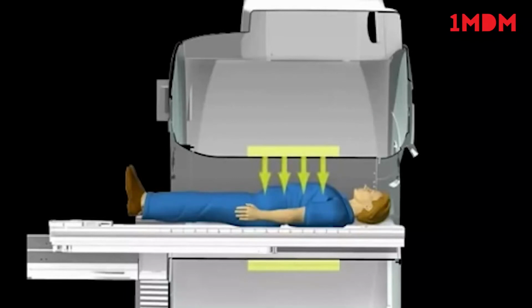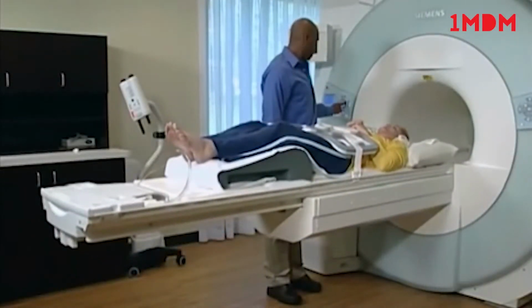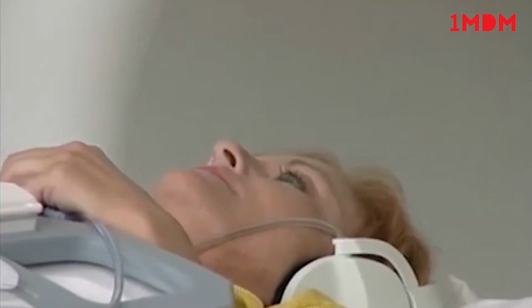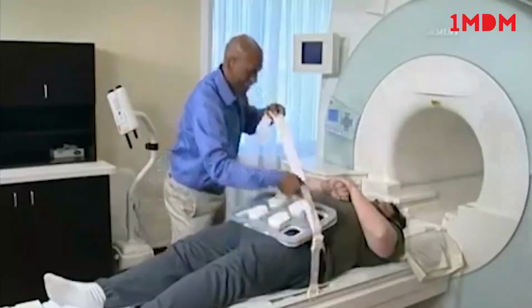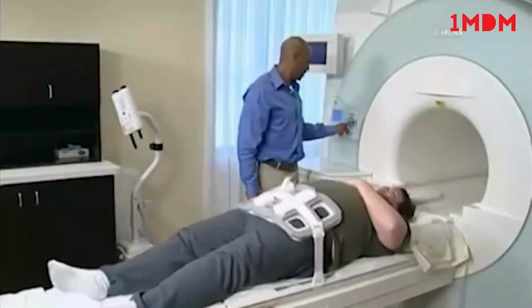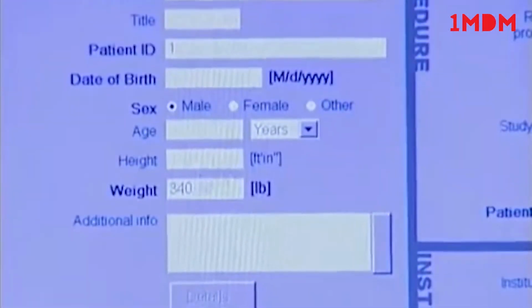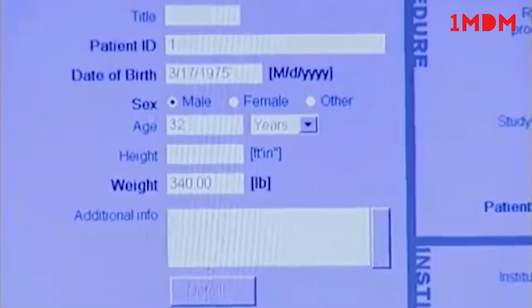The RF used in magnetic resonance imaging is absorbed by the body and can cause localized warmth. For safety reasons, control circuits in the MR imager prevent the energy absorbed by the body, SAR, from exceeding safe thresholds. Since the computation of SAR involves the patient's weight, it is important to enter this information correctly during registration. The limit values are fixed by international safety standards.